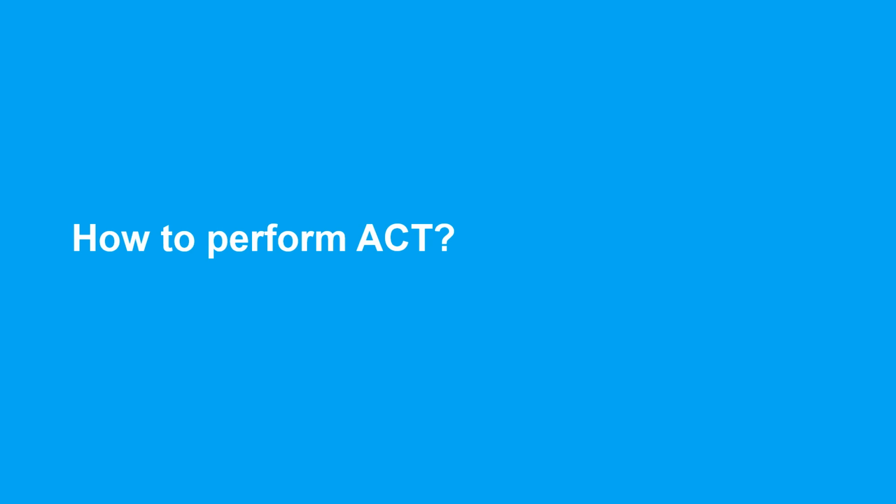How to perform ACT? The ACT test is like doing a pure tone audiometry test, but only with some background noise added. It was designed to have a very similar procedure as PTA. Now, I will show you a video where you will see the whole process from start to finish.